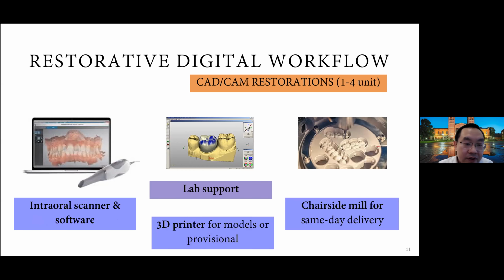Then how expensive is this all going to be, right? So you're going to need intraoral scanner software, right? And you're going to need lab support, finding a lab that's able to do that, which is not a difficult thing nowadays, right? But you may have to try out a few labs before you decide on the one that's really forming a good rapport with you, that works well with you, that's turning out good quality work. And you might need a 3D printer if you want to have models printed out in your own office, or to print provisional crowns as well, right? You might want to have a chairside mill if you're doing same day delivery.